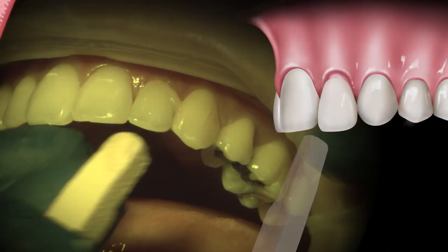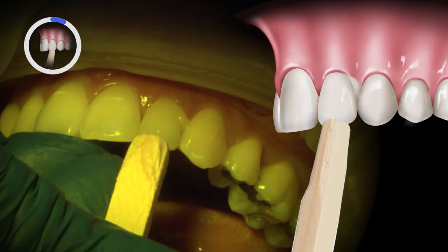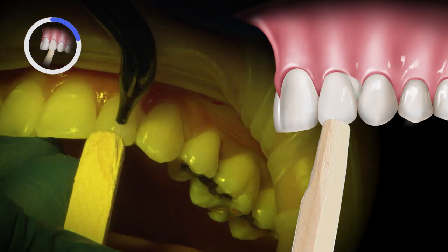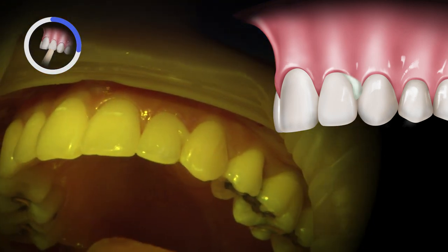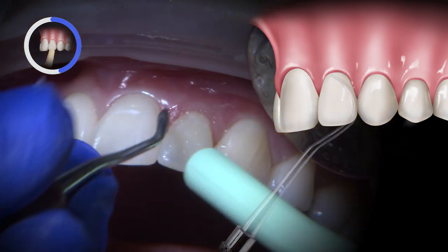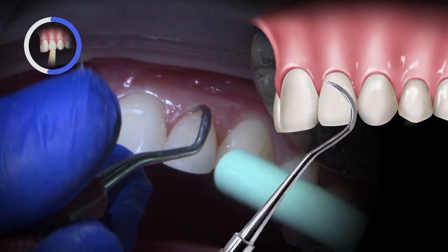Applying gentle pressure with a bite stick helps keep the crown seated in the correct position during the curing process. Tac-Cure Mode is recommended for predictable curing and easier removal of excess cement. I gently removed excess cement with a clean micro-brush and scaling instrument.